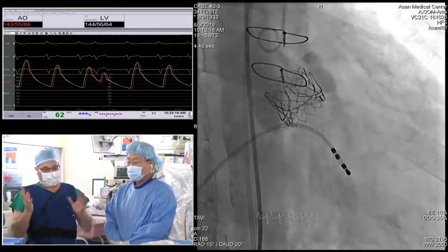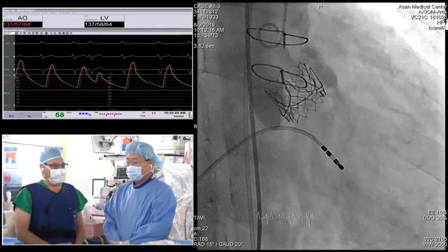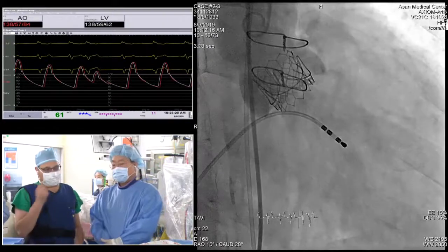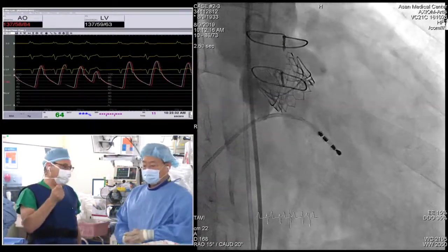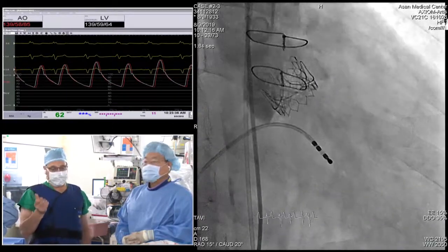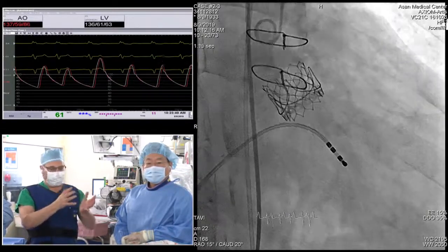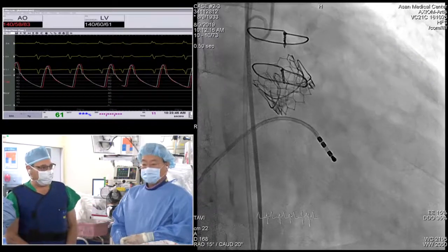One of the nice things about the United States is there are so many different ways of doing it, so we have a little mini randomized trial of all the different techniques. What we have seen is that if you fracture the valve, we can generally get very similar final gradients with a balloon expandable as with a CoreValve. So the advantage of the CoreValve with small annuli tends to go down if you fracture, because you can overcome it. But you might not have to fracture if you use a CoreValve in the first place.